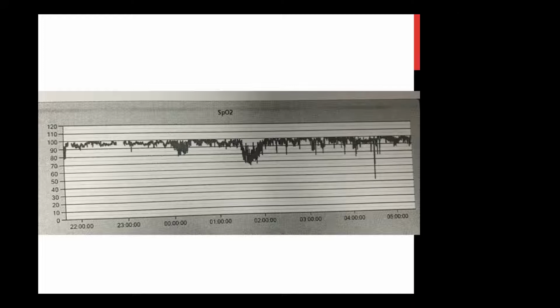Throughout the whole night, there seems to be maybe something like obstructive sleep apnea. There's some general sawtoothing to the oximetry signal present the whole night. But there's a portion in the beginning, and then this portion in the middle, where there's a persistent drop in the overall oxygen saturation. It doesn't really return to baseline, and that sawtoothing becomes more profound.